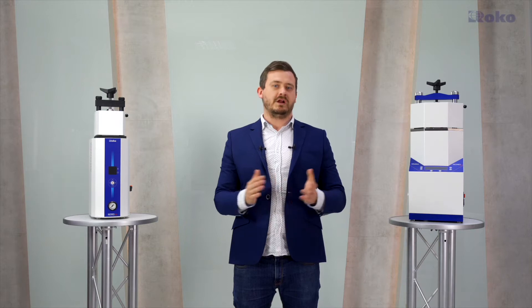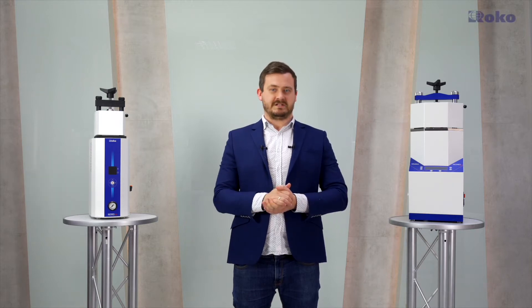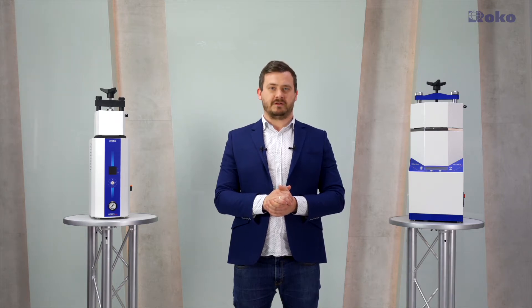Multipress has a unique design that allows effective injection of dentures from any material. Welcome to the presentation of the Multipress Injection Machine. I'll show you what kind of advantages make Multipress stand out from others.